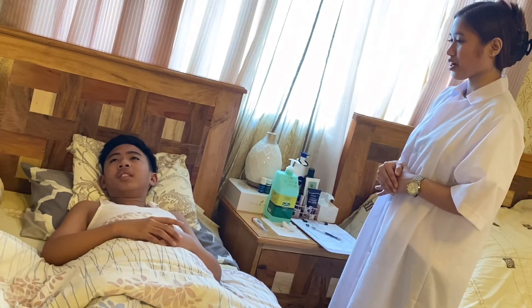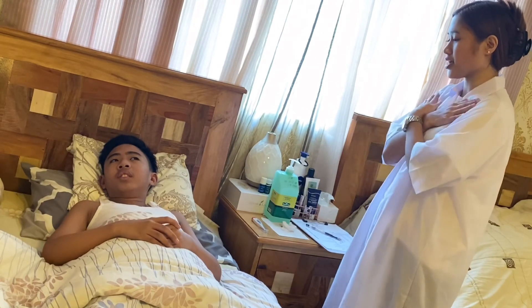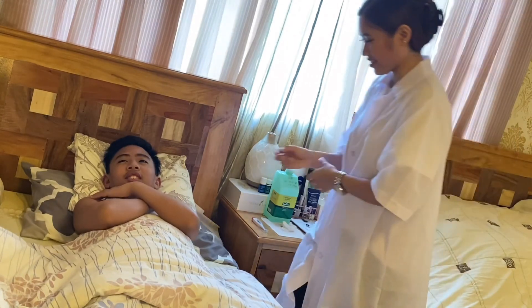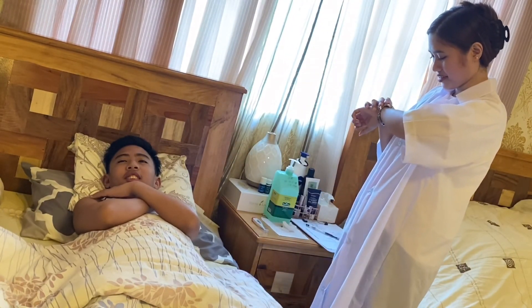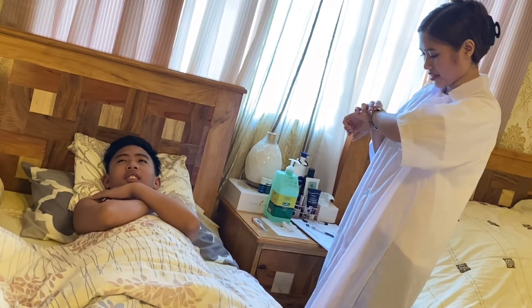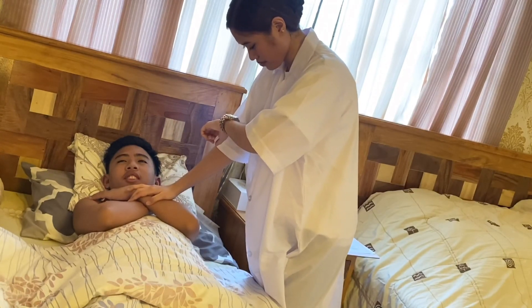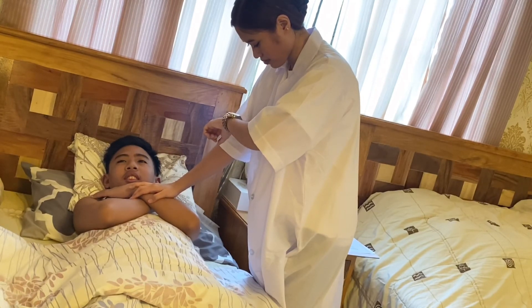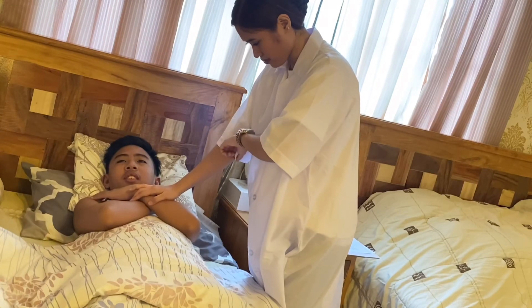Yes. For the respiration, observe and count the respiratory rate. If you anticipate the client's awareness of respiratory assessment, place a hand against the chest to feel the chest movements with breathing. Count the respiratory rate for 60 seconds — an inhalation and an exhalation count as one respiration. Observe the depth, rhythm, and character of respiration.